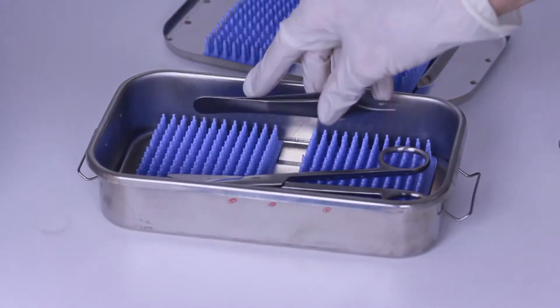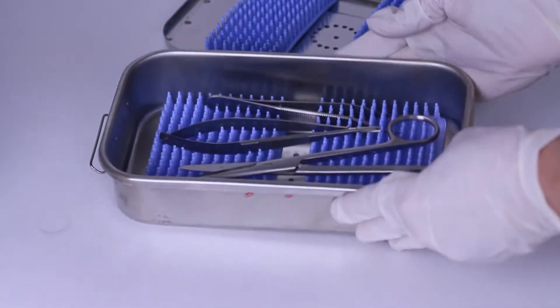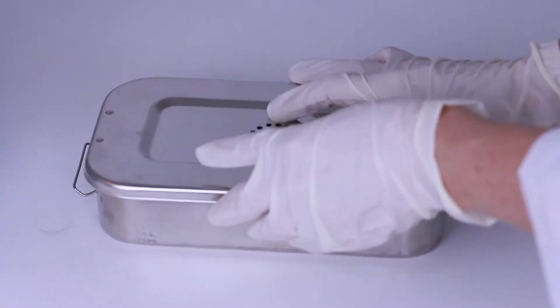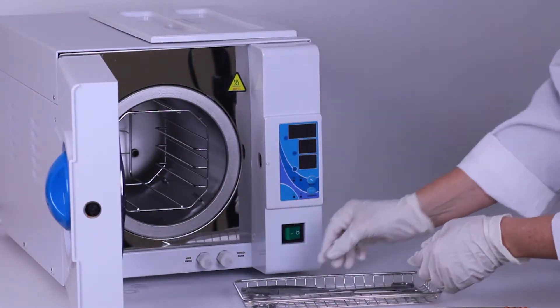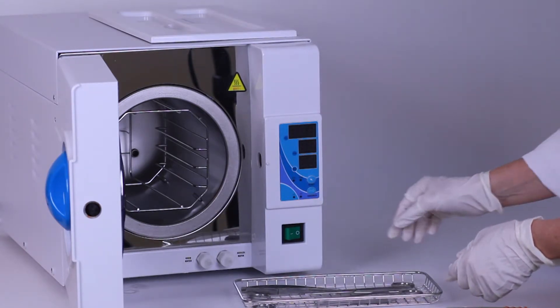Instruments can be placed in sterilization trays or wrapped in paper or muslin before autoclaving. This helps to prevent contamination of the instruments after sterilization. Arrange the instruments, sterilization trays, or packs in the autoclave without stacking them. The steam must circulate freely inside the autoclave.